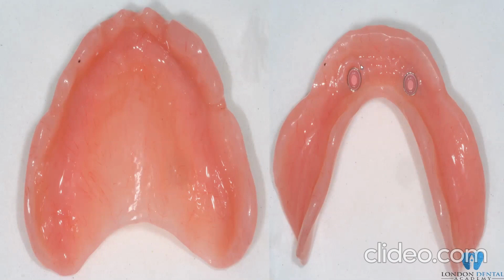Now, most people come after 6 to 12 months complaining of loose dentures, and the reason behind it is that the insert has been damaged or worn down. These are made of PEEK material at the end of the day, and it doesn't stay forever. So we need to make sure we have enough in stock to change them. Again, one of the problems I normally face is that dentists send them back saying, I don't have the tools to change the inserts.